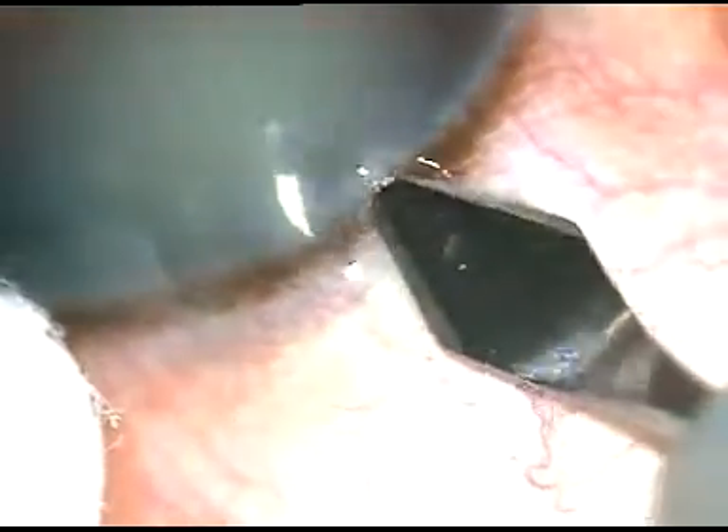Friends, this is a routine almost unedited phacoemulsification. Let us see how this surgery goes.